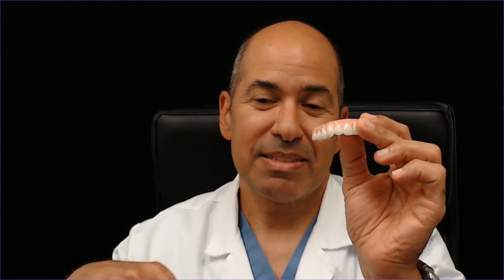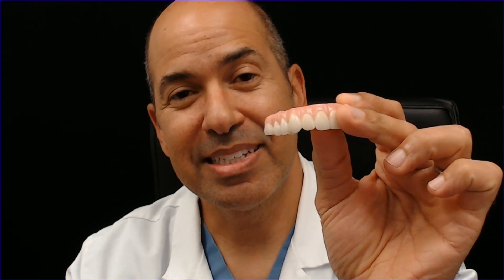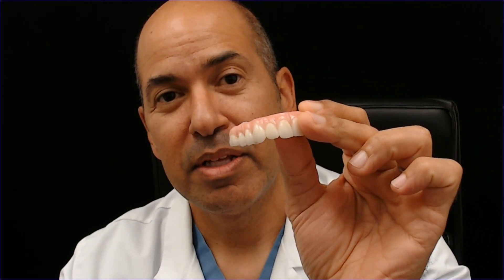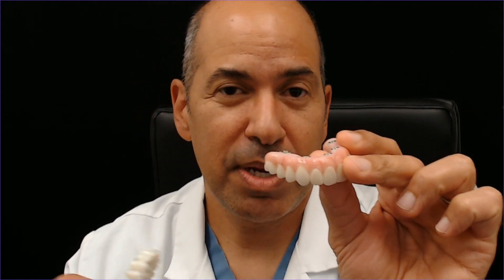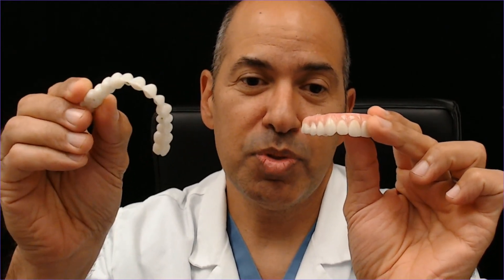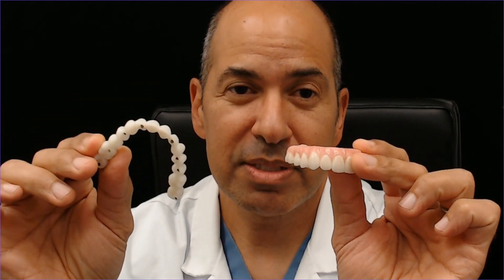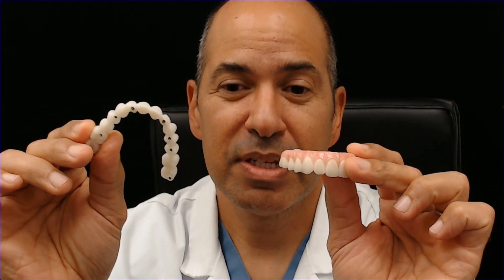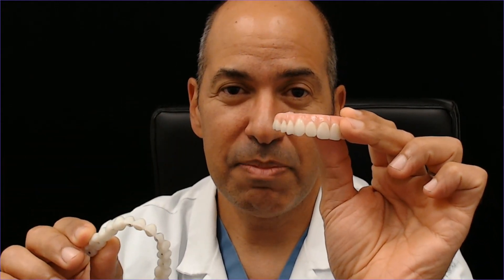The implants are placed much deeper on the FP3 than on the FP1, and that deeper placement is in better bone that doesn't tend to melt away. Some of my colleagues don't do FP1 at all because it's more time consuming, much more costly, and requires many more visits because it's hard to do.